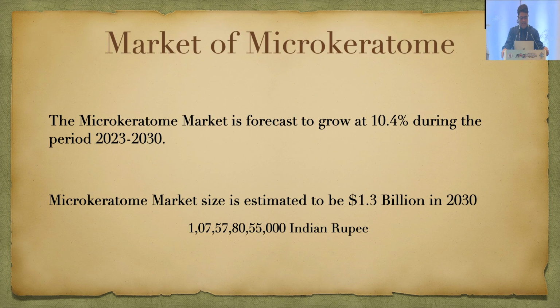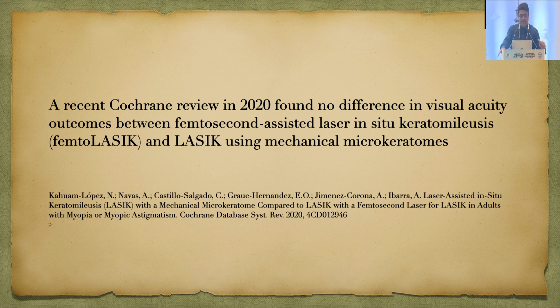So if anybody is thinking what is the scope of microkeratome, let me tell you the industry forecast that by 2030, the microkeratome market size will be $1.3 billion. I can't make out how many Indian rupees that is. So there's a huge market. We all know that 70% of the surgeons are still using microkeratome LASIK, and a recent Cochrane review in 2020 found there's no difference in visual acuity outcomes between femtosecond laser and microkeratome LASIK.